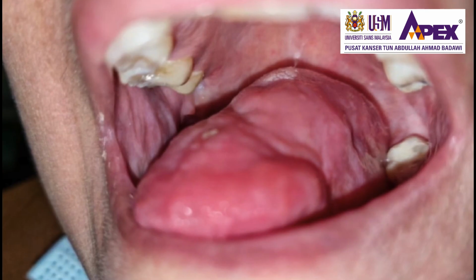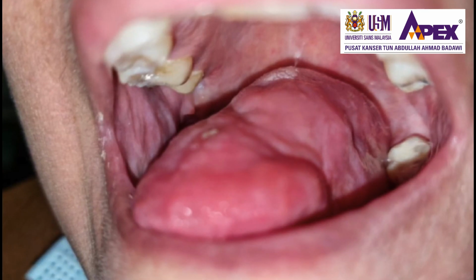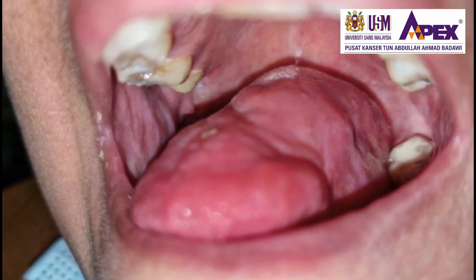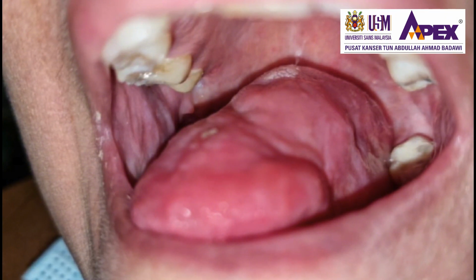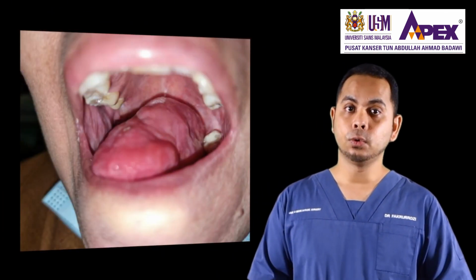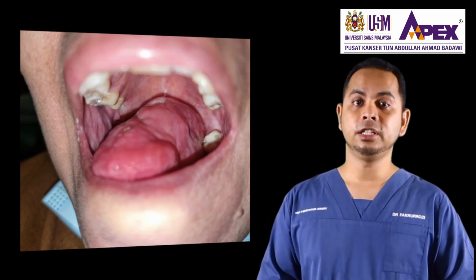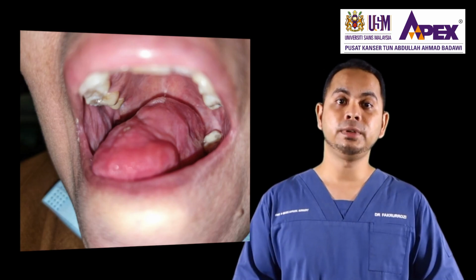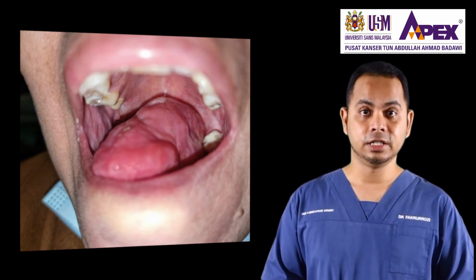The main advantage of brachytherapy is tissue sparing, meaning that the patient doesn't have to get tissue from a distant side of the body. The tissue present is the patient's own tongue, which will retain the function for taste, for speech, and also for mastication.